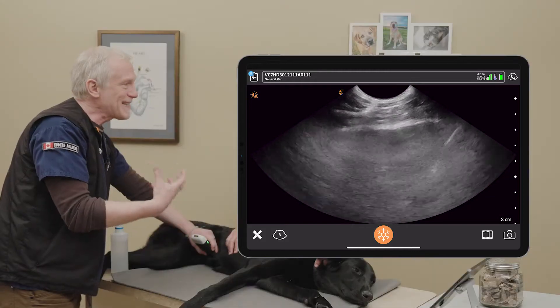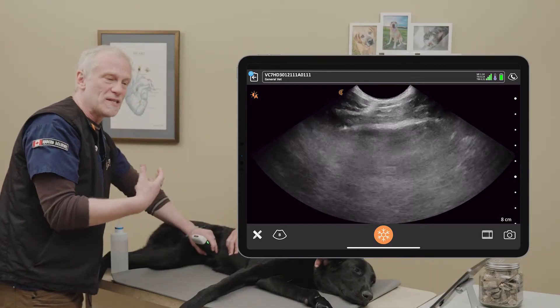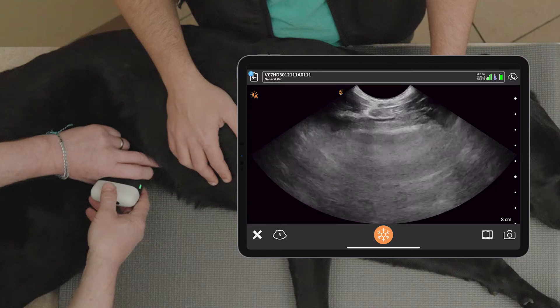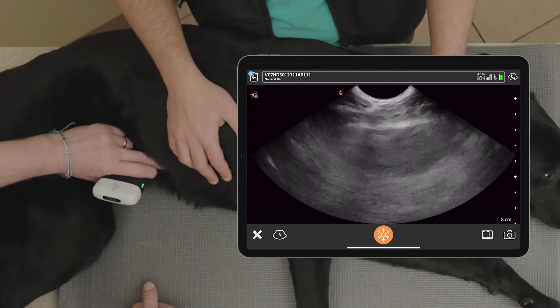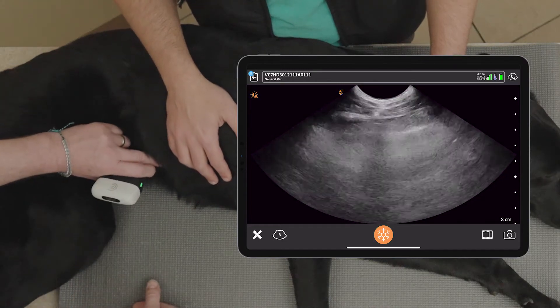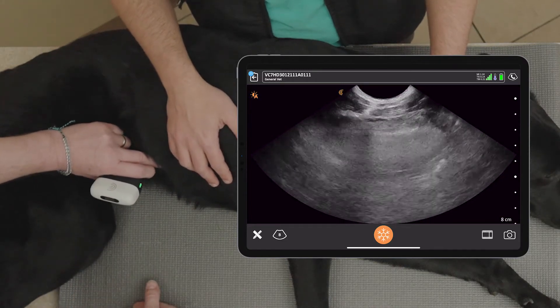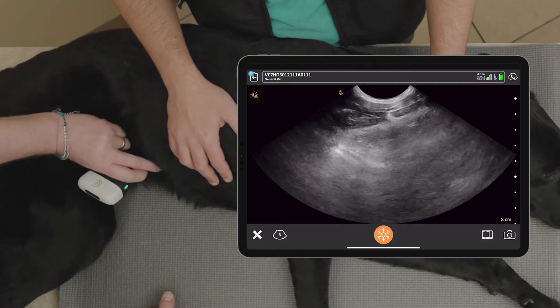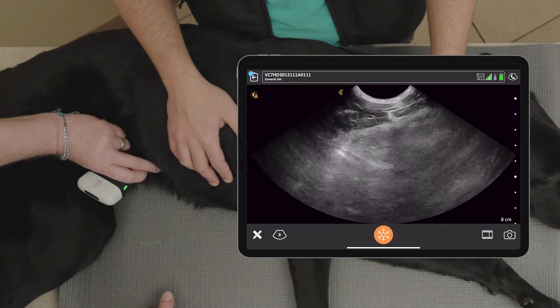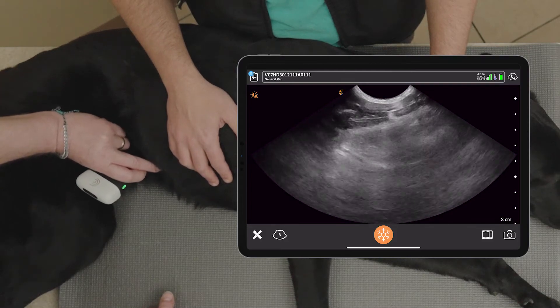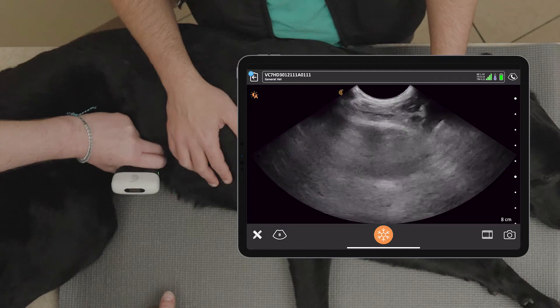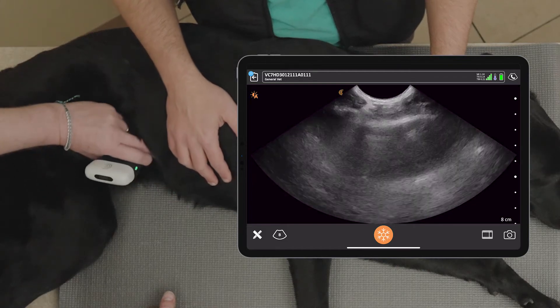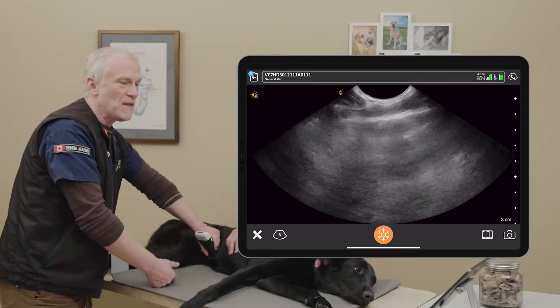So always think about the pathology you're looking for — in this case fluid — and where it will accumulate, and adjust your protocols accordingly. I'm scanning now down along that body wall because my patient's in lateral recumbency. I'll rotate or rock the probe cranially, and I'll rock the probe caudally, and then I will also fan at this location to increase the area I look at.